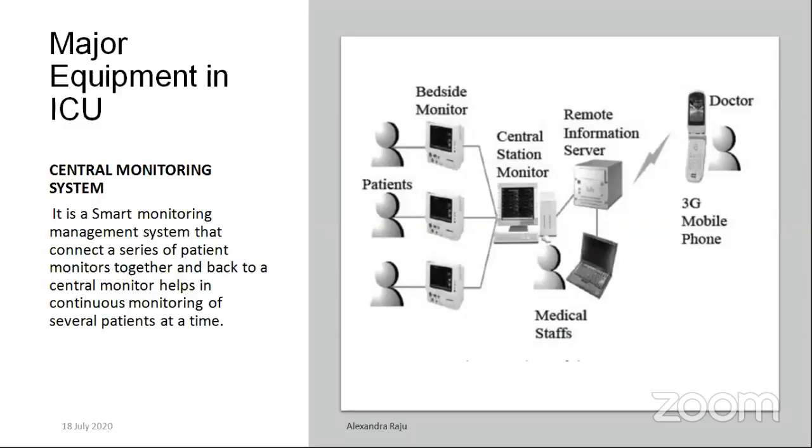So the major equipment that is available in ICU. Before going to that, I wanted to tell you a new advancement that is incorporated in ICU, that is a central monitoring system. It's a smart monitoring system.